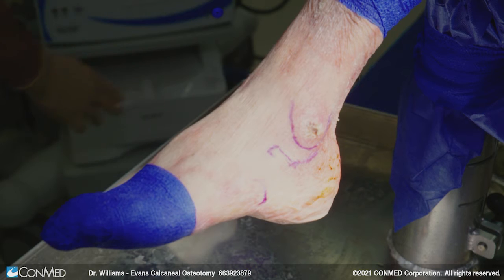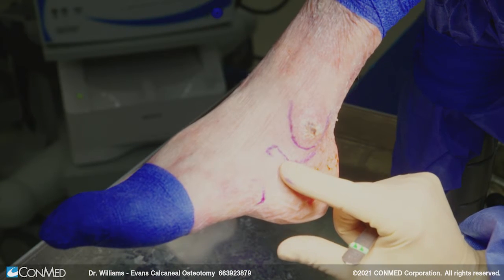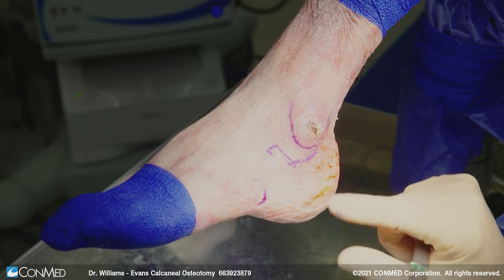Here we're going to demonstrate the technique for an Evans calcaneal osteotomy. Its indication is to help as a triplanar correction for forefoot abduction, forefoot varus, and it does have an effect on the calcaneal position and stance as well. This is one of the more powerful osteotomies to perform.